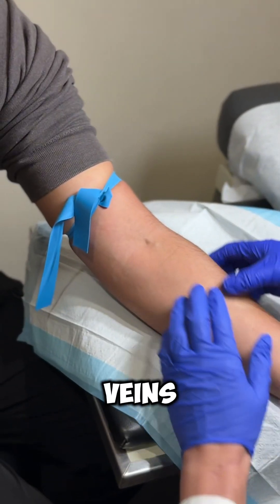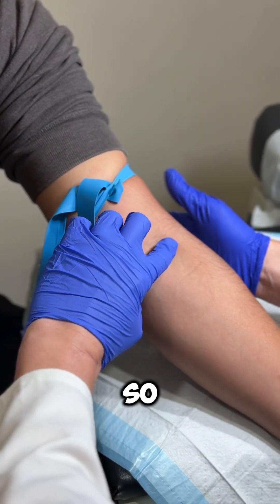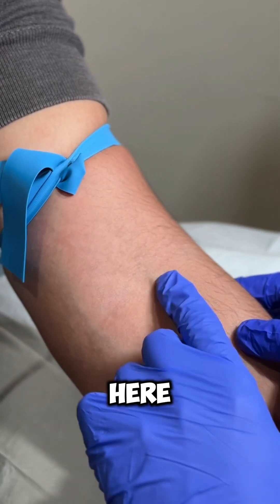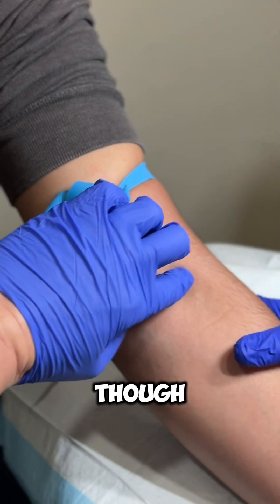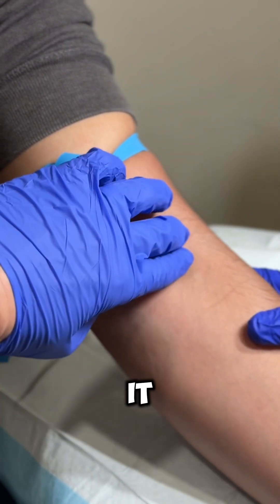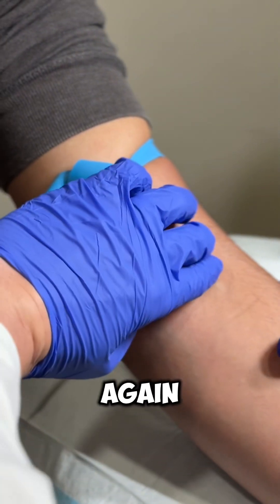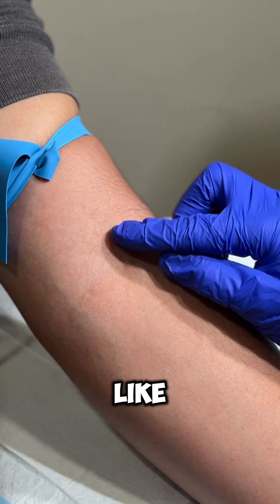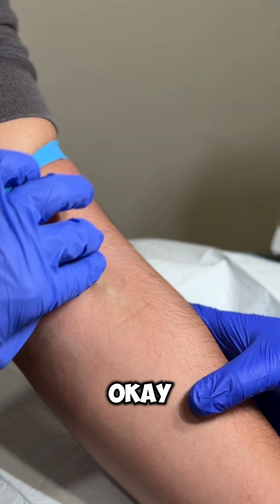Carlos has really good veins and I can see it's probably crossing right here, streaming right here. I feel the vein goes right up this way. Even though you see a little lump here and a larger lump here — that's a crossing and probably from an old blood draw. Even though it looks like it might be going this way, by feeling it I can tell Carlos's vein actually goes up this way. I'm assessing with my fingers.